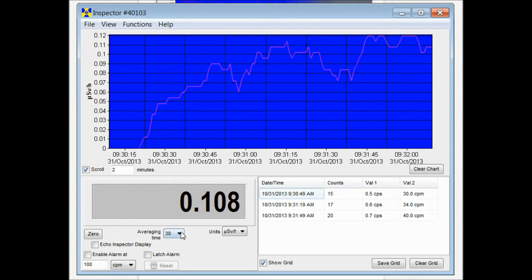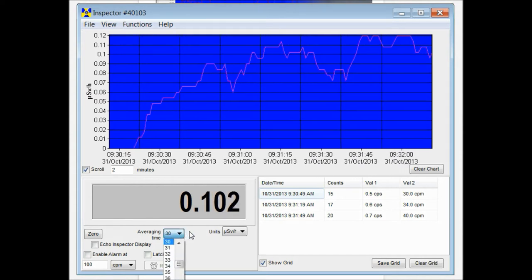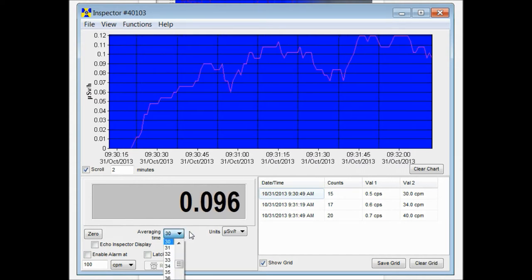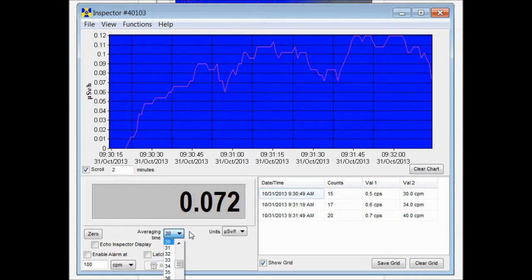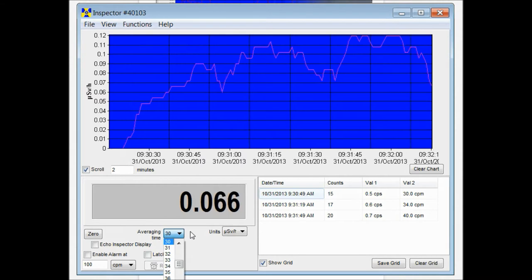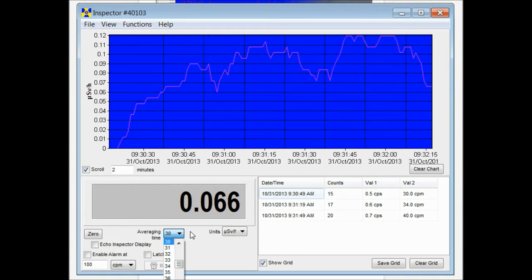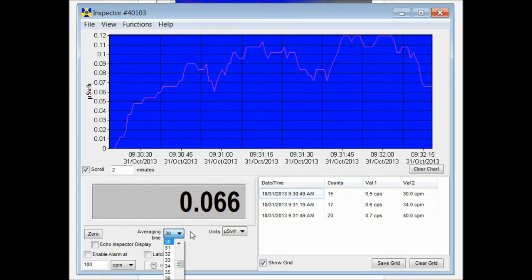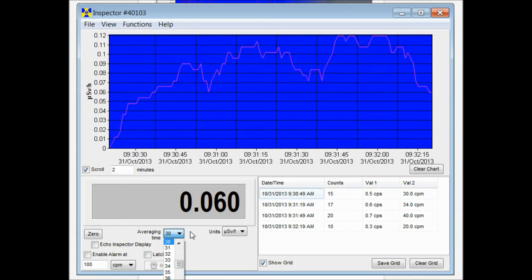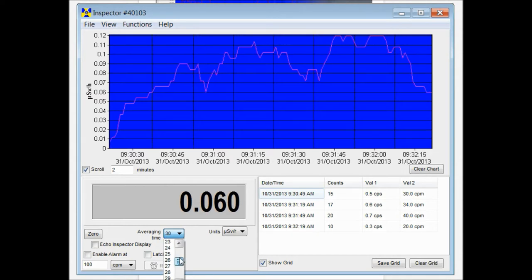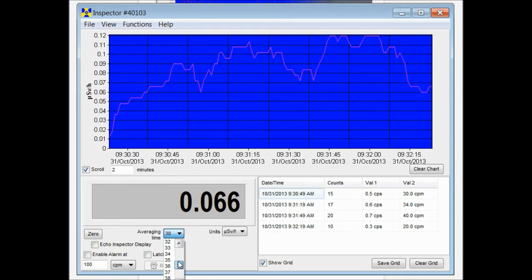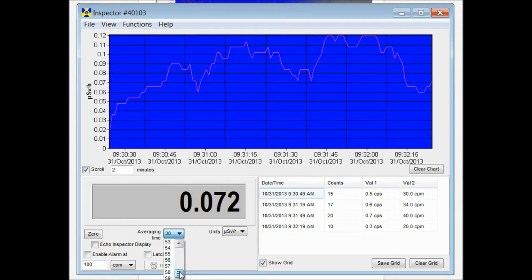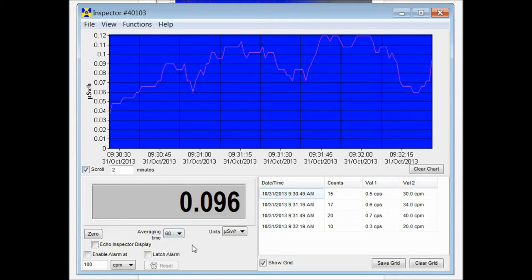The averaging time located right here is set at a default of 30 seconds. That mirrors the averaging time set as a default into the radiation detectors that you're using with the software. You can change the averaging time by scrolling down or up depending on where you want it to be. It goes up to a minute.